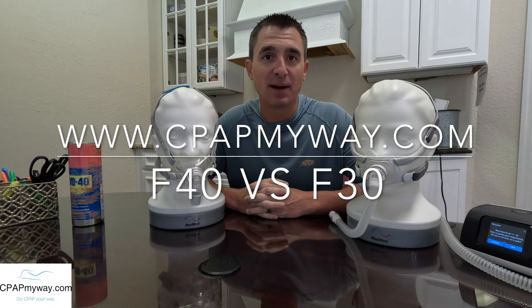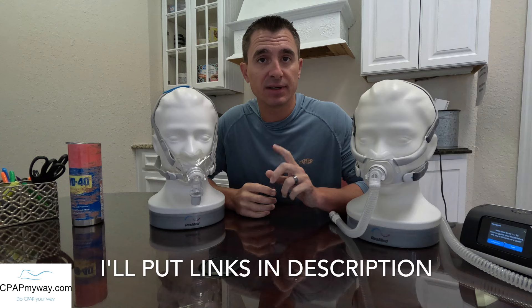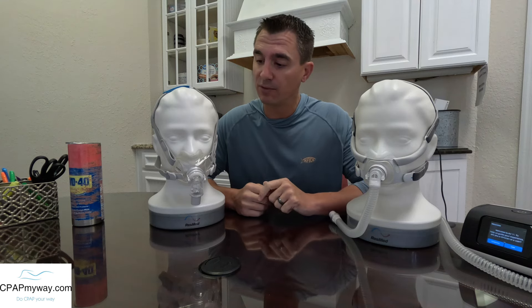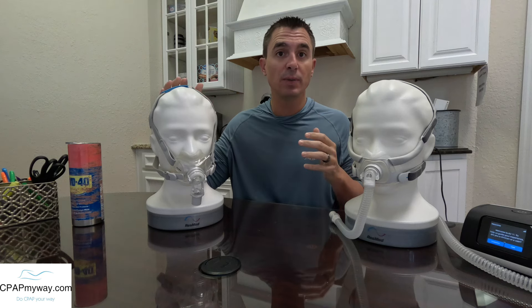Hey guys, it is Clay at CPAPMyWay, CPAPMyWay.com. Hopefully by now you've seen our new AirFit F40 intro and review video. If you haven't, I will put a link at the end here so you can take a look at that. Also, I'm going to put a link to our original F30 setup and review video as well. This video I'm going to be comparing the F40 to the previous F30 model so that you can understand the upgrades and how it may or may not fit you better.